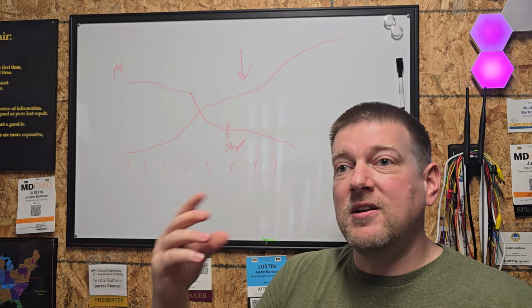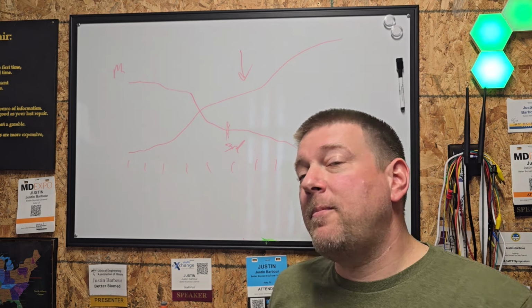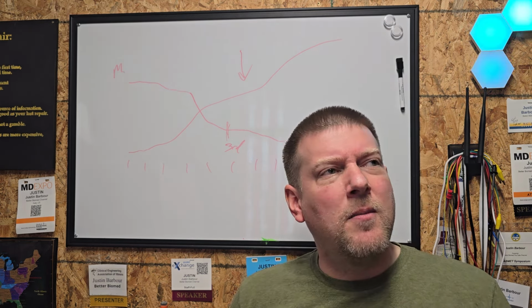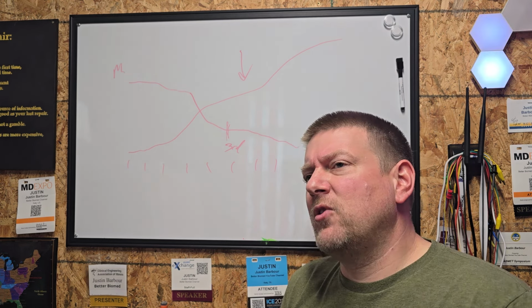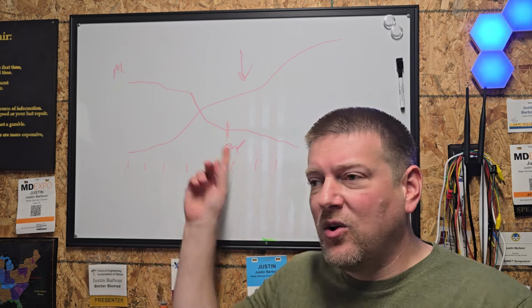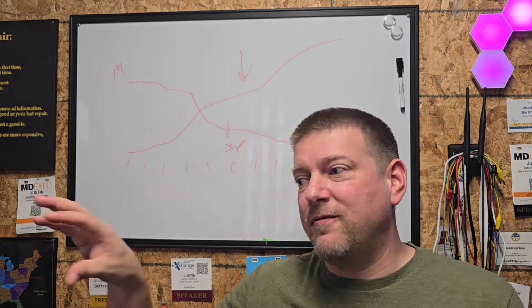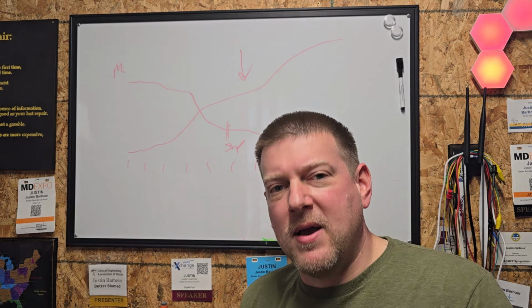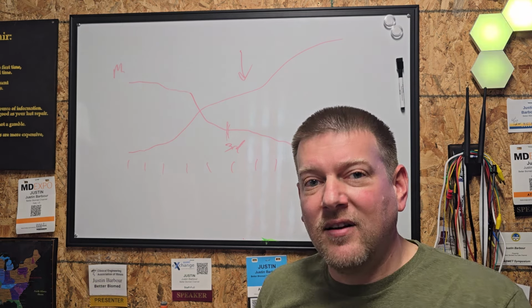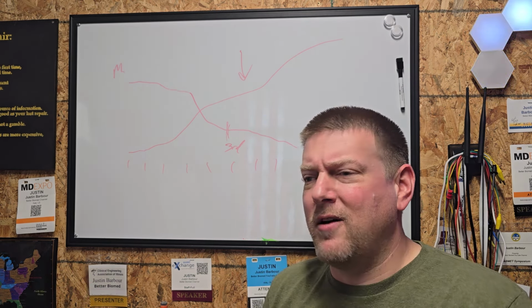That's when items end up on the third-party market, and all of a sudden we can get parts. And when you get parts, now you can start fixing things. And I know a lot of you guys out there are like, oh man, you're getting parts off other pieces of equipment, and so what? A lot of that medical equipment was still in use. So just because you can take an LCD screen from one, maybe a control panel or a front bezel from another, maybe a power supply, who cares? It doesn't matter. I mean, it minimally affects the risk whatsoever.